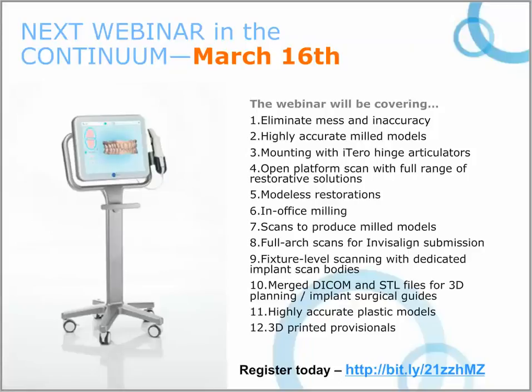We're going to take STL files, merge them with our DICOM files from our cone beam information, and create a virtual planning platform. We're going to then design where we want our implants to be. From that information, we're going to create a surgical guide printed by our 3D printer, and yes, we can print those in our office. And at the same time, using similar software, we're going to be able to create a provisional so that we can place the implant and place the provisional at the same time as surgery.